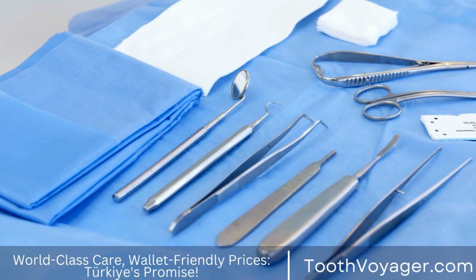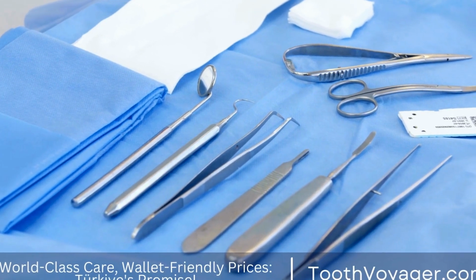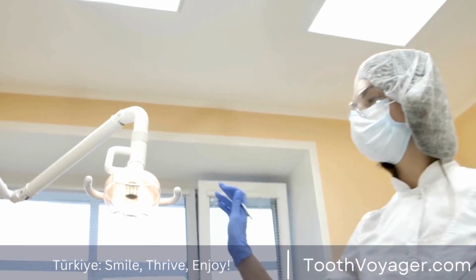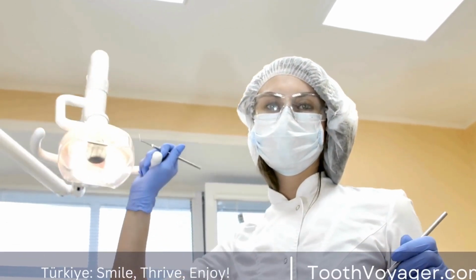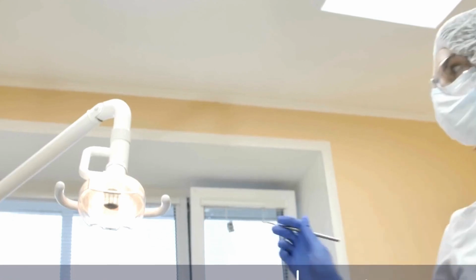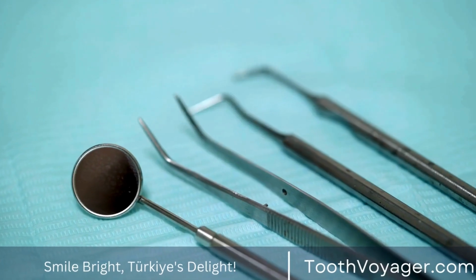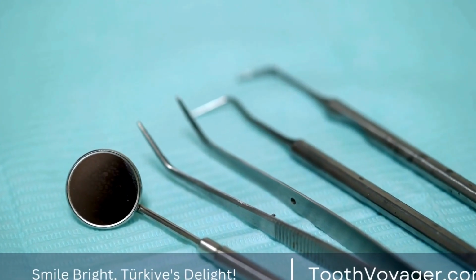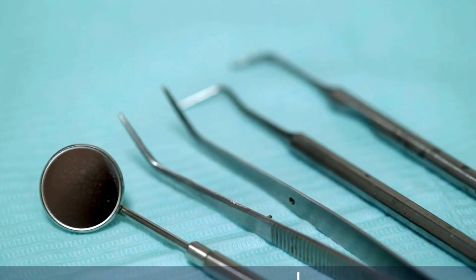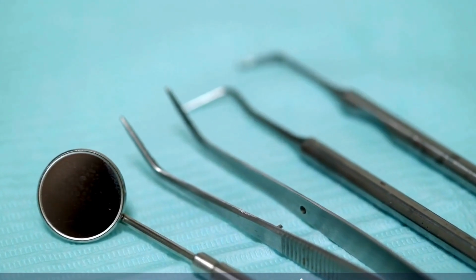When the impressions are made, the dental professional is able to use them for the creation of the dentures. This involves selecting the most suitable materials and creating the prosthetics so that they fit perfectly in the mouth of the patient. Making the dentures more comfortable can also mean changing the size, shape, and the color of prosthetics in order to complement the teeth of the patient and to enhance the appearance of their smile.